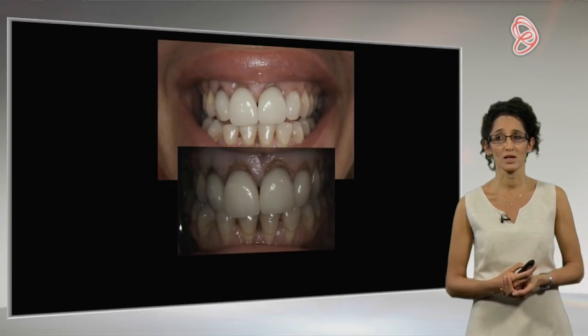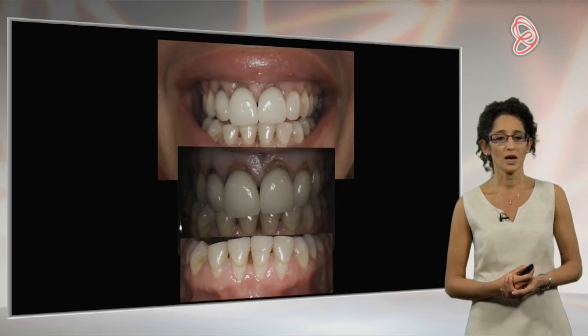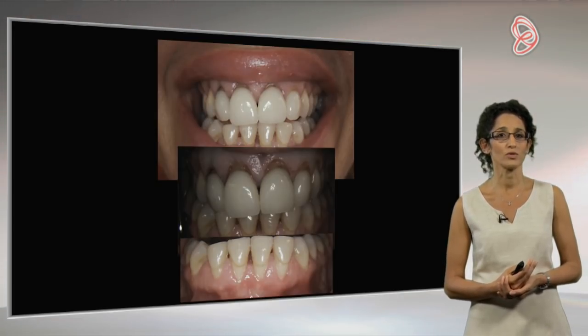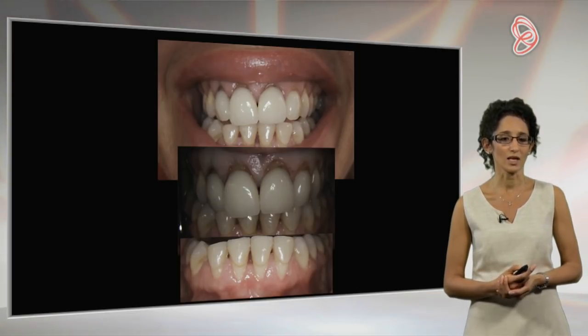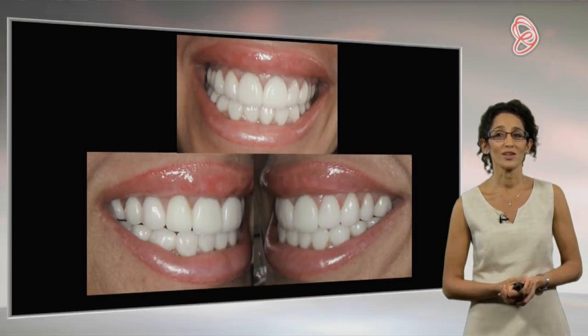You can see in that middle slide, I've just reshaped it a little bit, particularly the upper left lateral, and that's the lowers after a week. So again, you can see how that's really healed up beautifully, and I'm sure you can definitely imagine how it wouldn't be a problem to go ahead and get those crowns made pretty quickly. So this is her final shot.